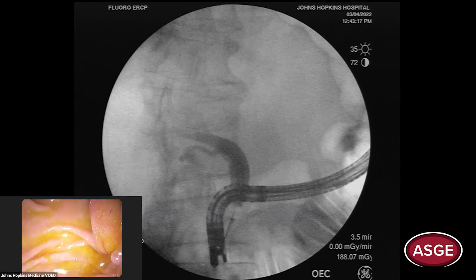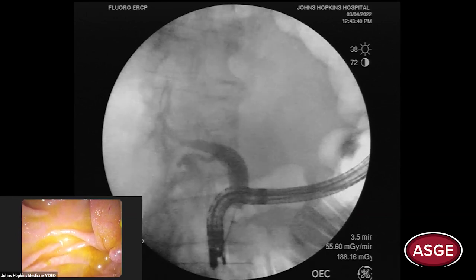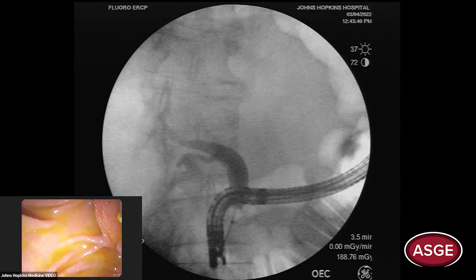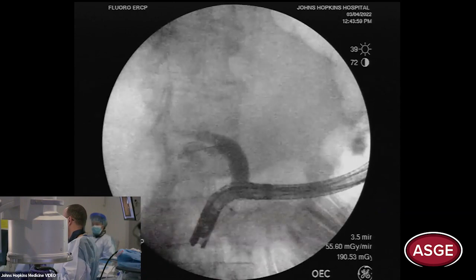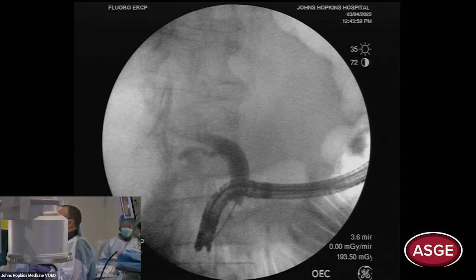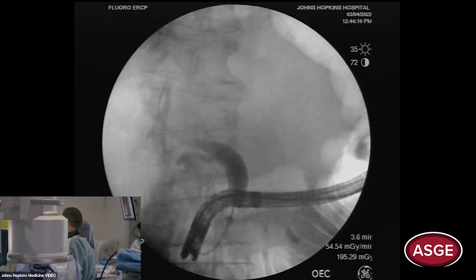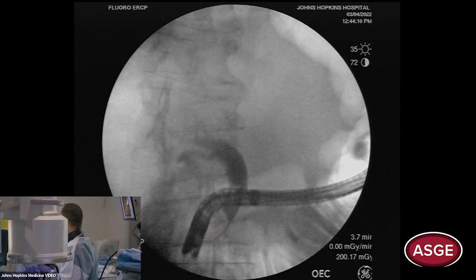By the way, he has antiphospholipid syndrome — came in with an INR of around 5. He has to go on anticoagulation right away, so it's going to be a sphincteroplasty-type approach. The plan: put a wire up, place a stent, and come out — decompress him, let the track heal, and come back for a more elective ERCP with sphincteroplasty. Let's push the wire up and place the stent.